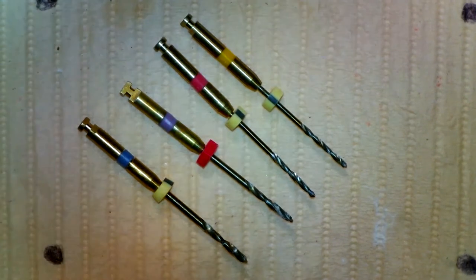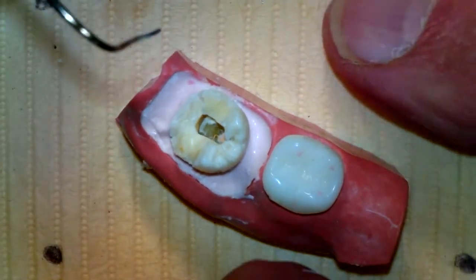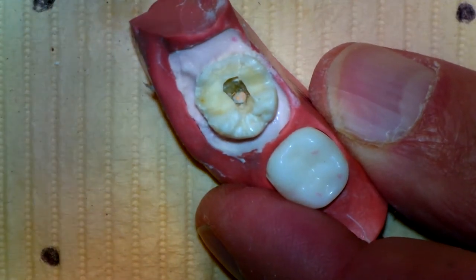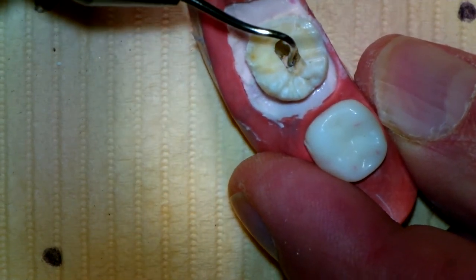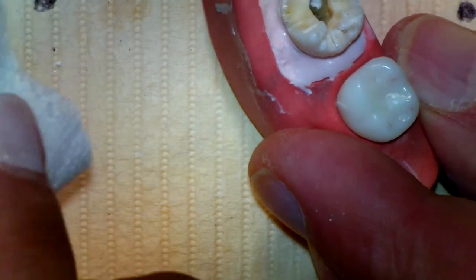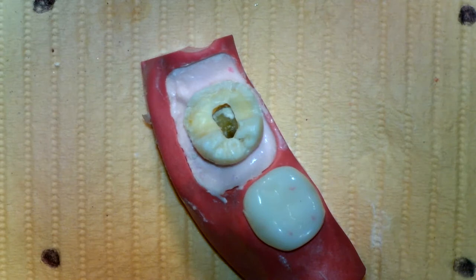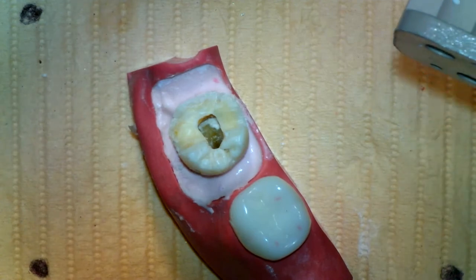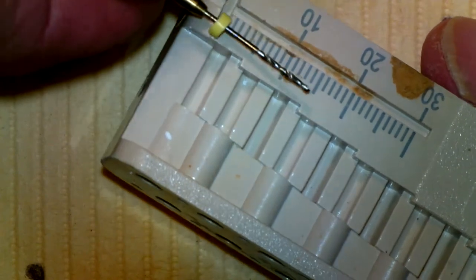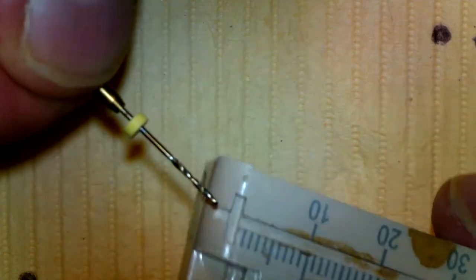We're going to determine if there's any curve that won't let the post go deeper by making the post space now. First, I'm going to take the touch and heat — you can see the gutta percha in the distal canal. I'll put the touch and heat on cold, turn it on, go in a few millimeters, take my finger off, and take some gutta percha off to create an initial space. Then I'm going to take the smallest post — the size 3 — set it at 14 millimeters and put that in the slow speed handpiece, making sure the speed is on about 20.